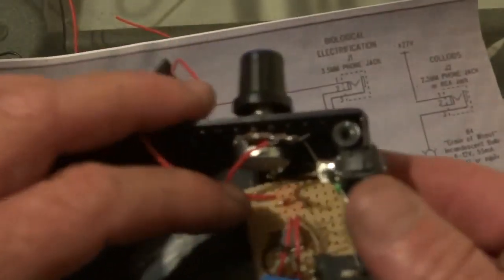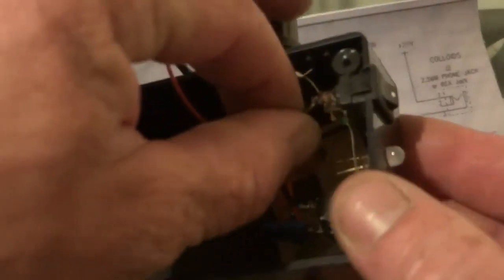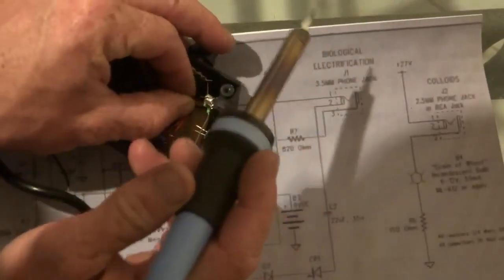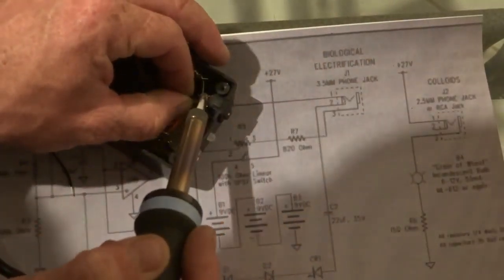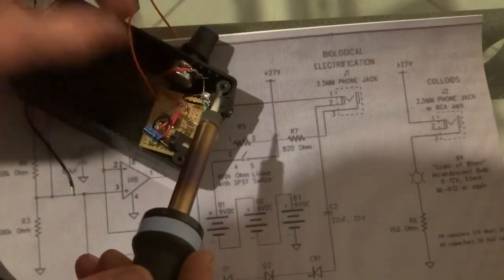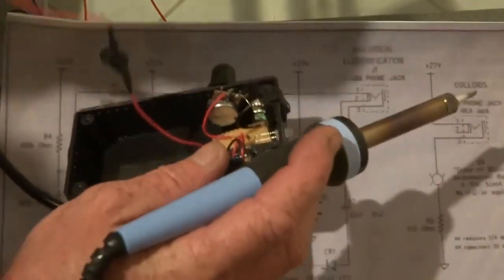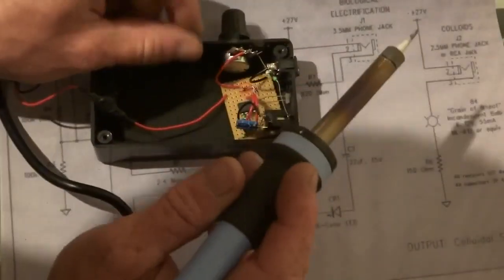The next step is to get the negative wire — the earth wire that comes out off the board — and solder that to the switch. That one goes on the top, and the earth wire that comes off the nine-volt wire that you've made goes onto the other side of the switch.